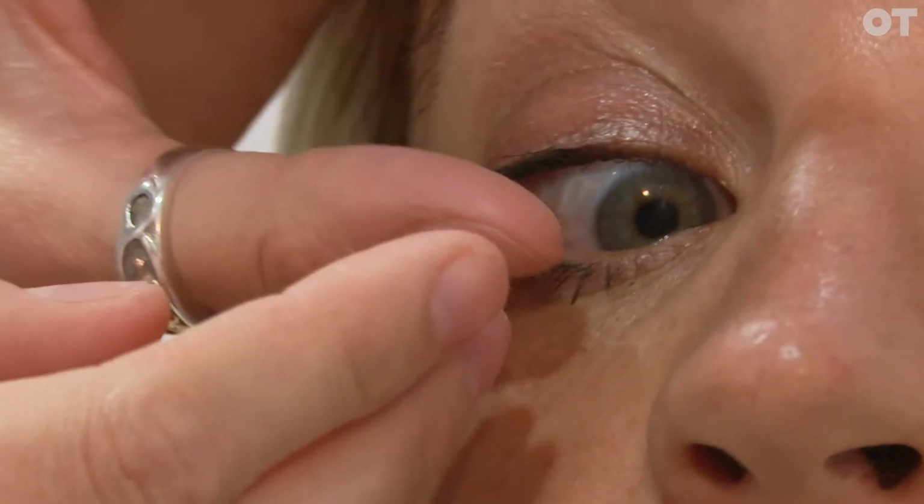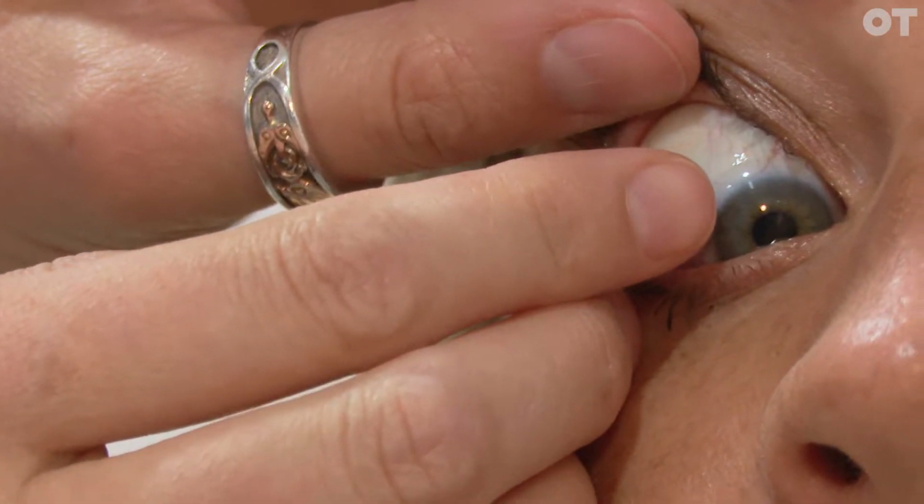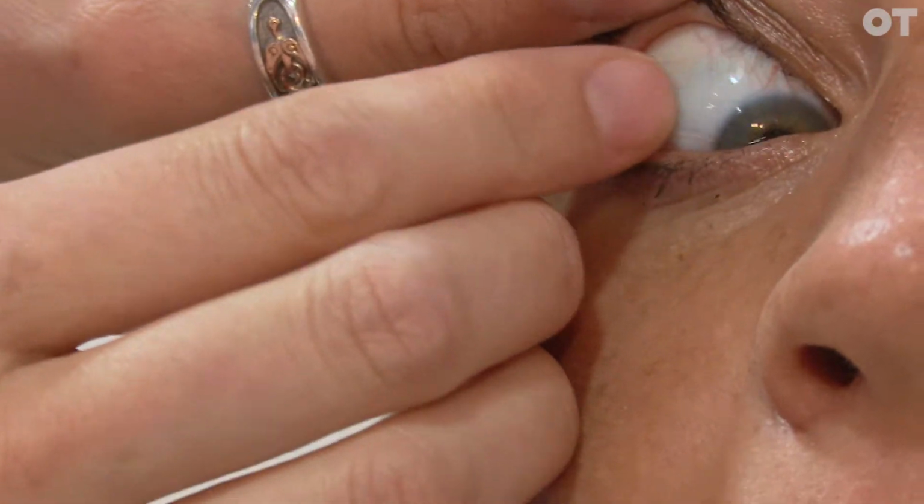If they're a little bit aware of it, then of course you can do the scleral swish, where you move it onto the white of the eye, wobble it about a little bit and push it back into the centre. That will often get any air bubbles out from underneath the lens, or if there's a little speck of fluff or something, it just washes fresh tears underneath the lens and lets that settle really quickly, and then they go, oh, that's instantly better. If it's not, you need to take that lens out, rinse it, clean it, look at it.